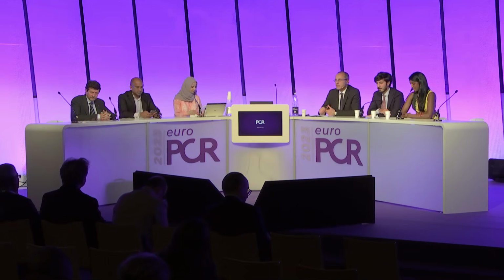I think we have 1 minute left. Allow me to just wrap up the session. We learned a lot, I must say, from the colleagues and from the discussion and from your contribution. First of all, on the key role of intravascular imaging, IVUS in particular, in this complex coronary setting. It is very simple to adopt. If we want to address key questions, we just need to follow a stepwise approach. IVUS can help us at every step of the procedure, before, during, after.